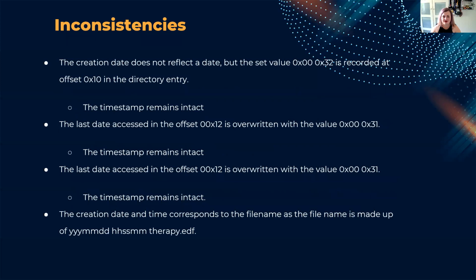Now, I did note that there were some inconsistencies. When I examined the deleted file directory entries to determine the information that I could understand, there were some inconsistencies with regards to the dates and times recorded in the directory entries. This was anticipated just because it's a medical device. Sometimes it throws in a loop or it throws in a surprise.